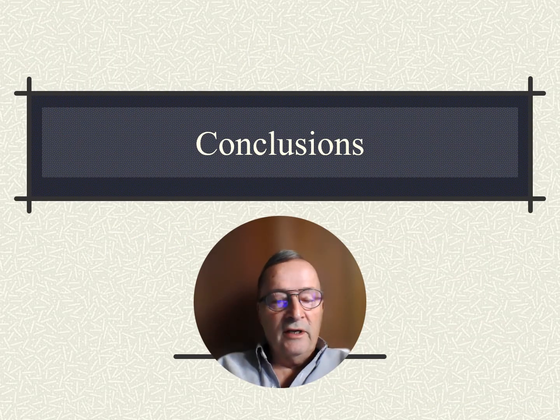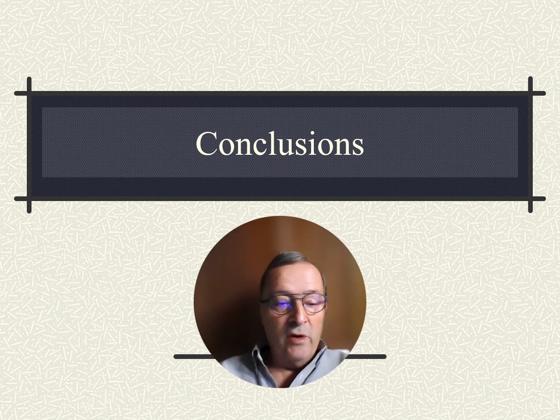In conclusion, the gynecological ultrasound is not a screening ultrasound. It is based on clinical indications and a rigorous technique, taking into account the recommendation I've just presented to you.